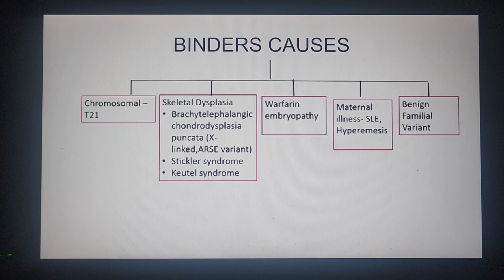So I hope you learnt a lot about binders. It's a common occurrence. Learn to pick it up in the mid-sagittal view. Learn to measure the frontonasal angle. Learn to watch for premature ossifications, and if they are there, document stippling. And once you have this association, insist on an amniocentesis, show the variant and the gene abnormality, and counsel regarding termination. To continue or not, obviously, are the parents' choice.